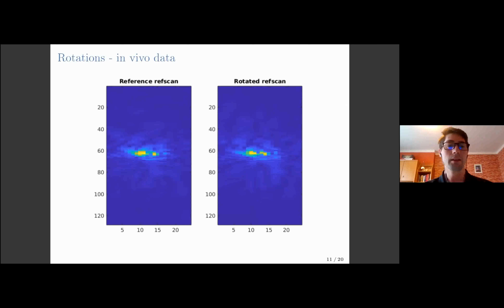And actually, we also thought that in order to speed up everything, also the acquisition, we probably cannot acquire the whole FatNavs, but we can take just the reference scan, which is a low resolution scan, which is fully sampled, and it's there for all the acquisitions. So perhaps those low resolution scans would be just enough to find the motion parameters.